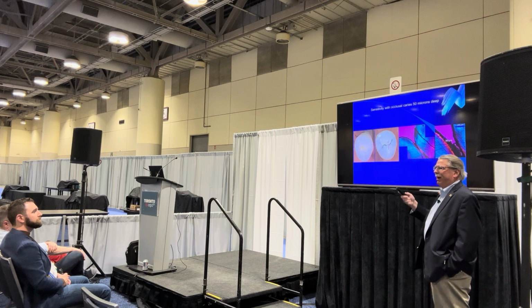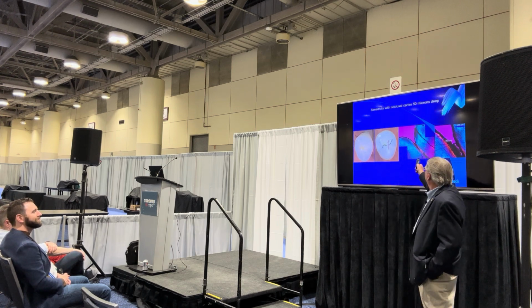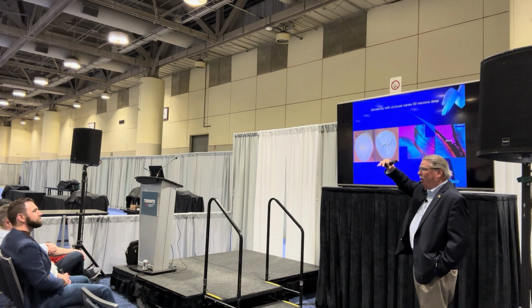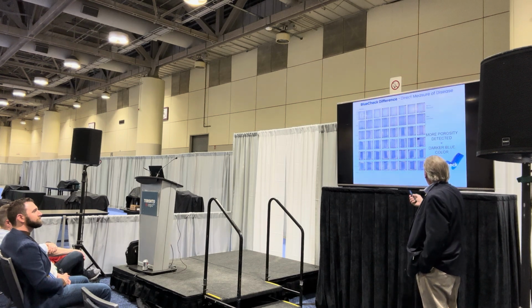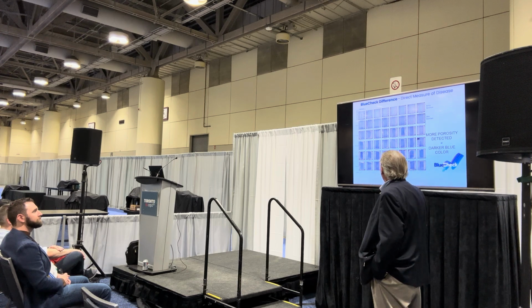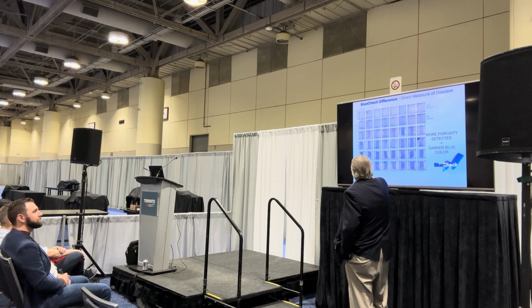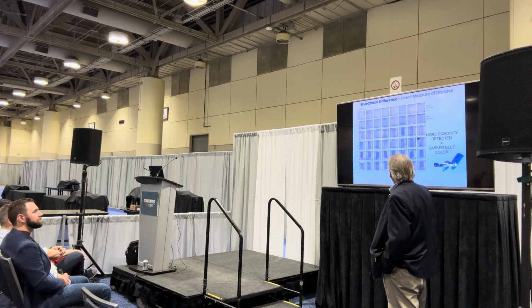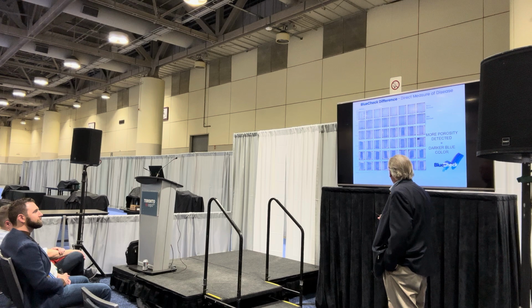And sometimes I take it for granted everybody understands this stuff because I've worked with it so much, but no, this is blue enamel, and this is a fissure on the occlusal part. So they can measure at 50 microns, but I think this slide says 1,000 words. So it shows the depth of the etch over here, and then the time that it was in solution, and they're consistent on the more it's there, the bluer it gets.